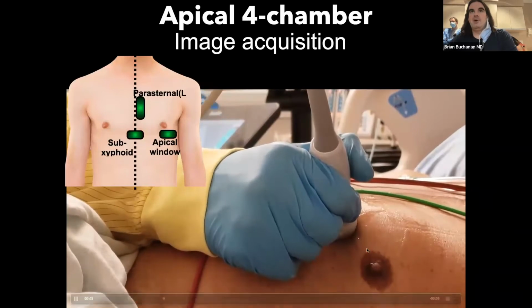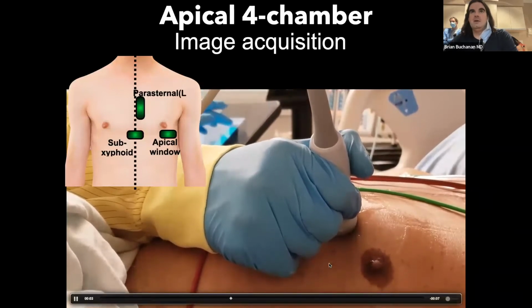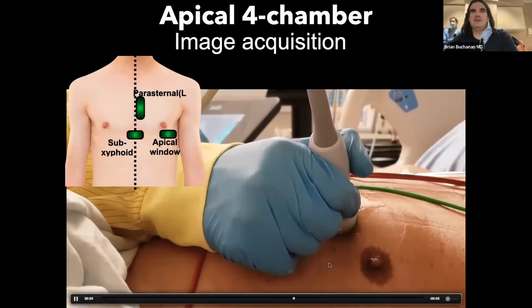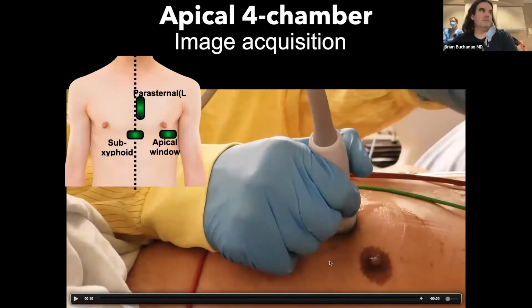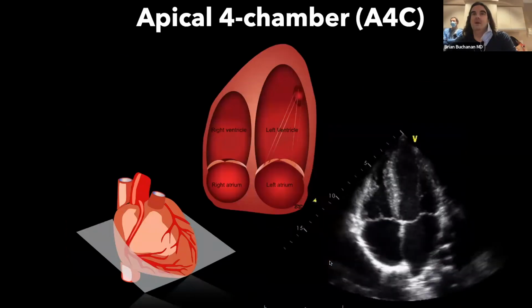Your apical four-chamber, marker towards the bed. If you feel the apical impulse, that will give you a rough sense of where the apex is, but of course it doesn't always correlate. The best way to acquire this is to have the patient lie in decubitus, but it does shift the apex more laterally. So here we go.